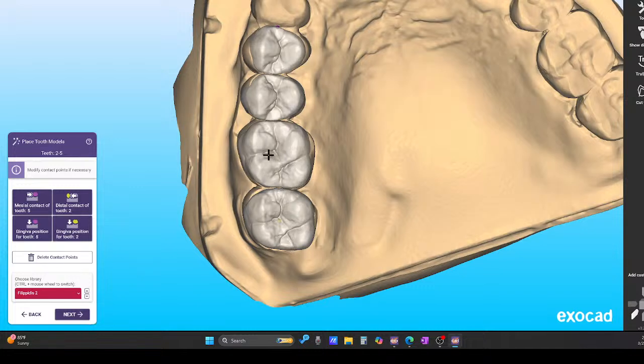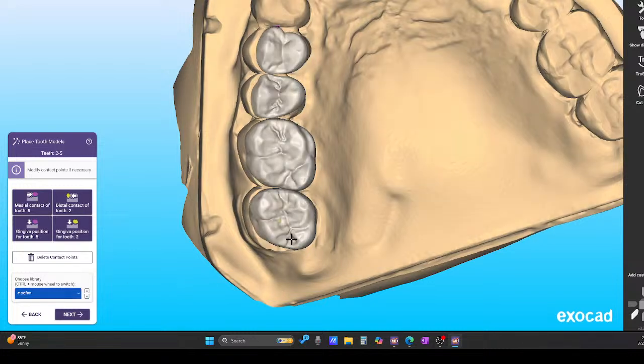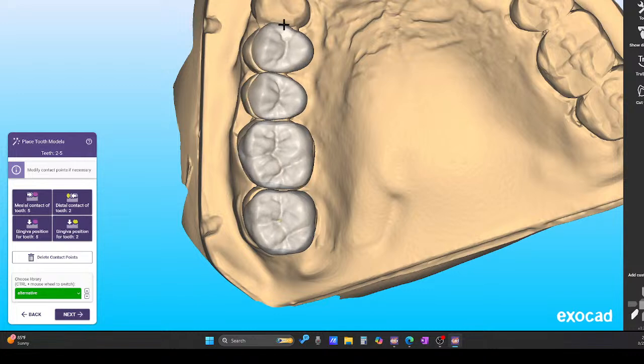And if anything, you don't want a lot of ridges and stuff because you're going to be making some occlusal adjustments. So choose something that has flat planes and at the same time kind of covers most of the teeth that you have. If not, you're gonna have to be doing a lot of moving and adding and sculpting, and you don't want to do that. So I feel like this is close enough. Let's see. That looks close enough to me.